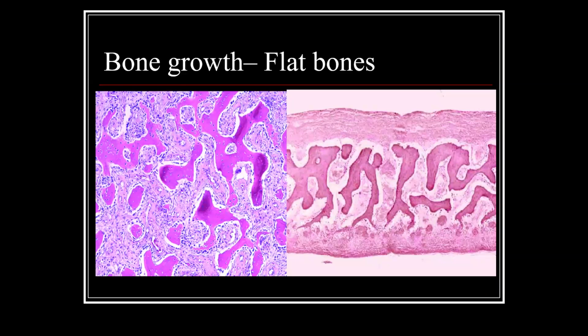But we realize that flat bones don't develop from an endochondral type of ossification, but are more of a fibrous matrix derived bone with peripheral osteoblastic rimming around these trabeculae, and that helps to distinguish new woven bone pattern growth.